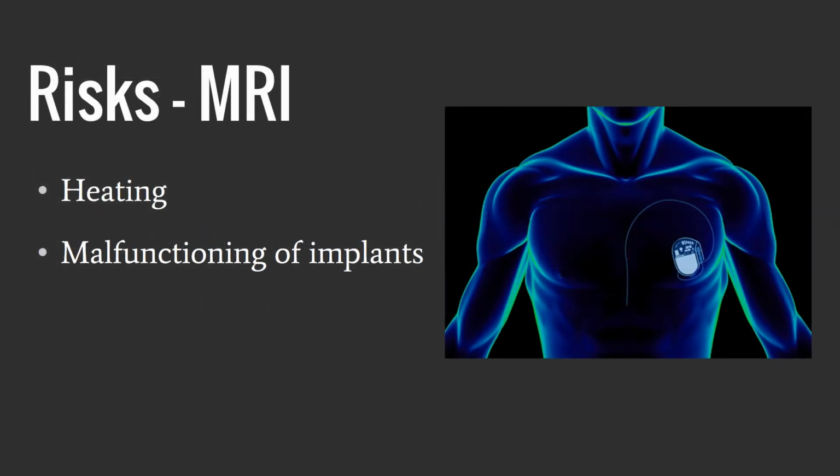The risks regarding MRI. Well, the radio waves and energy during an MRI scan are attracted to metals, so metallic implants in the patients may have a rise in heat during the MRI scan. Because of this, the magnetic field then becomes unstable and unreliable, and it may also clash with implants that emit energy, such as a pacemaker, as seen in the photo. This can cause the pacemaker to malfunction.